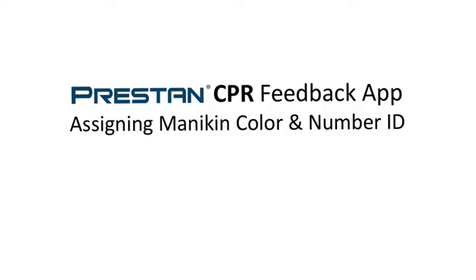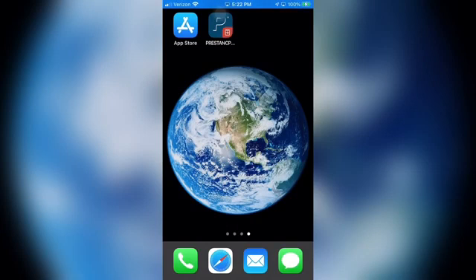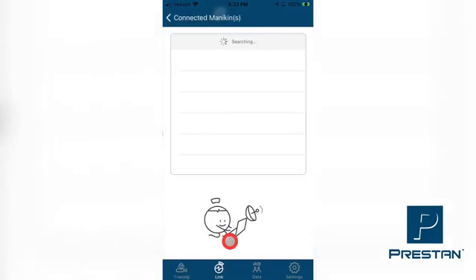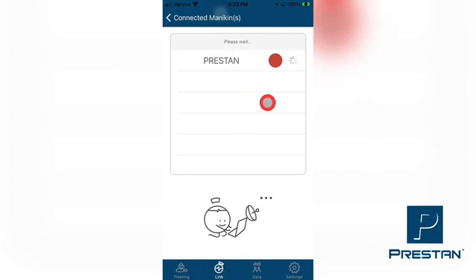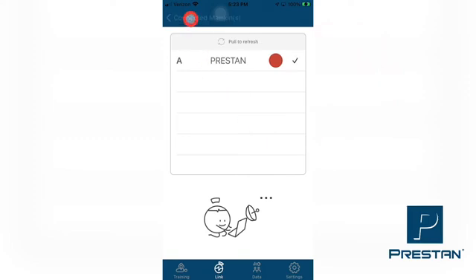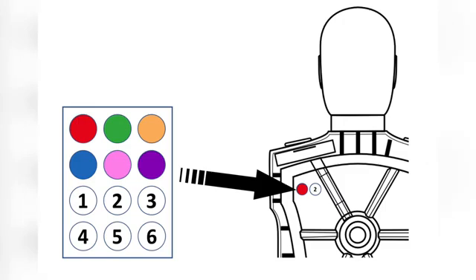Assigning Mannequin Color and Number ID: to assign your mannequin a color and number label for easy identification during training, select the Link tab found at the bottom of the screen. Select Search Mannequin. A list of connected mannequins will appear. Select the desired mannequin from the list, ensure that a checkmark appears next to the name of the selected mannequin. Select Connected Mannequins, and then select the chosen mannequin from the list. Tap the Change button in the row titled Color ID. The mannequin will start beeping every 5 seconds, indicating that you physically have the correct mannequin selected on your app.